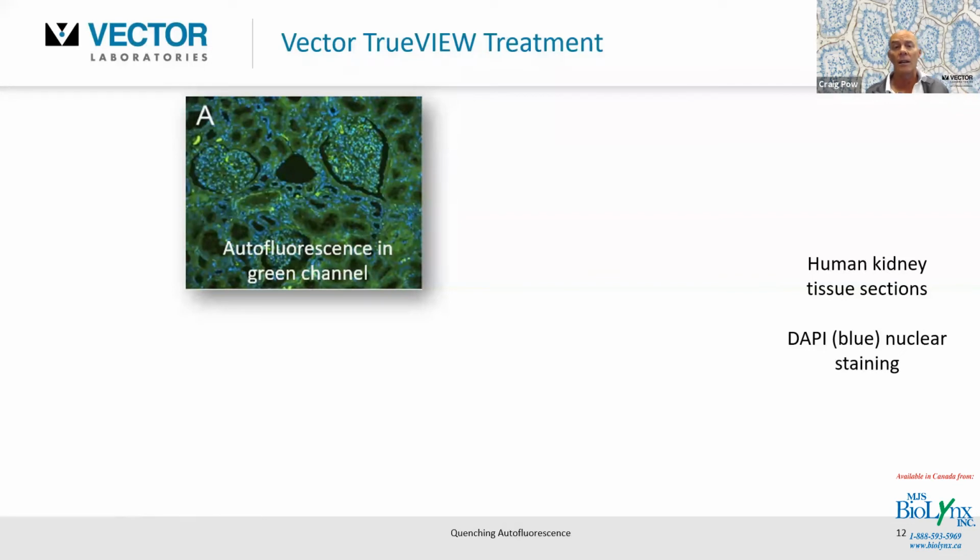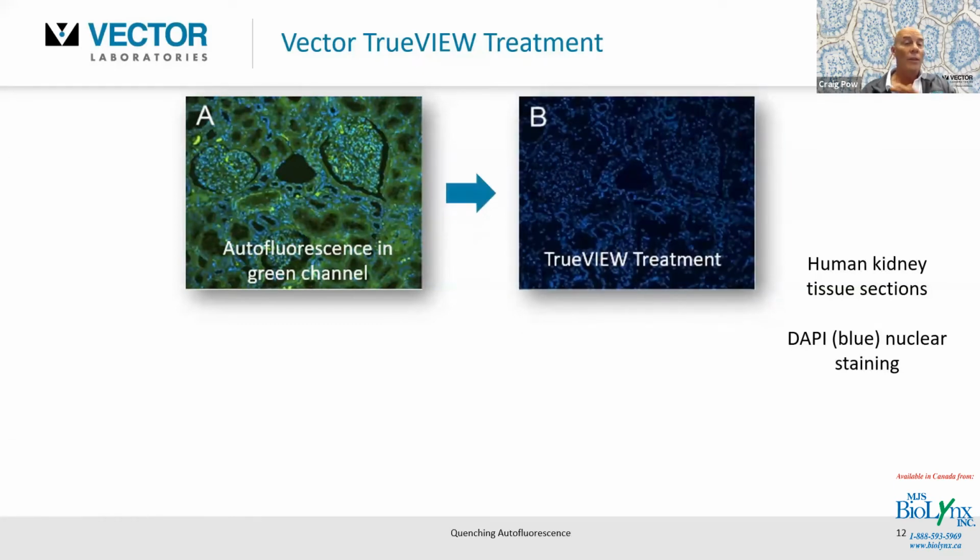And here's human kidney sections, some serial sections here. And this particular section is simply just a cut tissue section of human kidney looked at under the green channel. I will say that it has been counterstained with DAPI, so we can identify some of the underlying tissue morphology and architecture. And this is the extent of autofluorescence in the green channel. So when we treat it with TrueView, what happens? All of that background autofluorescence is eliminated, and you can certainly see now the nice blue DAPI nuclear counterstain and a deep dark background. So if you did have a specific green signal there you were trying to identify, this would make it certainly a lot easier.